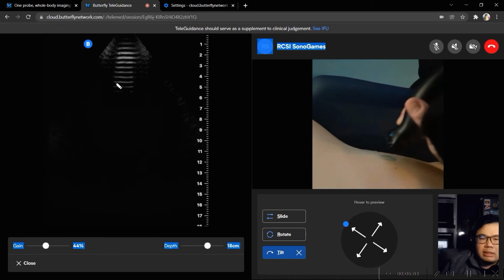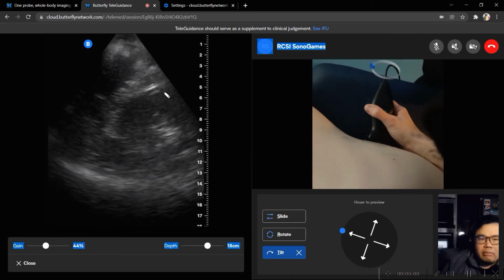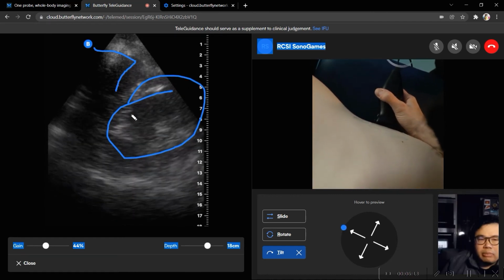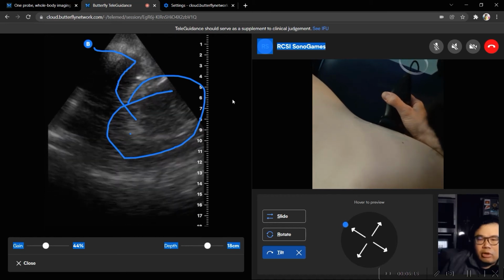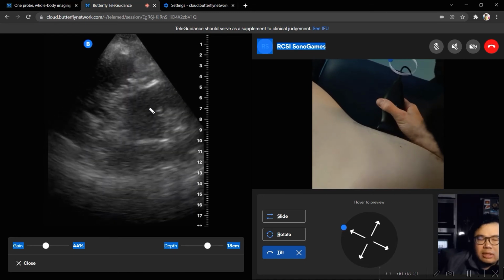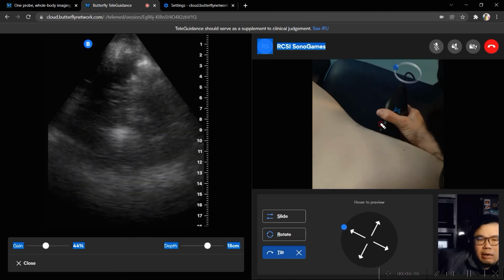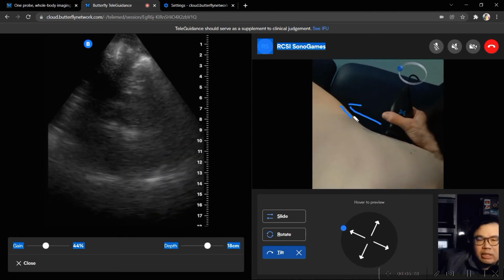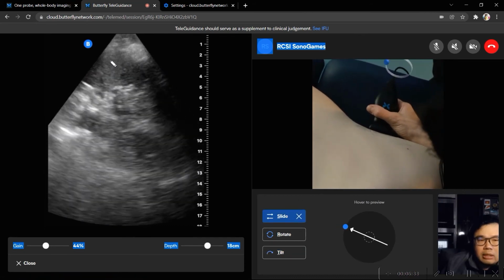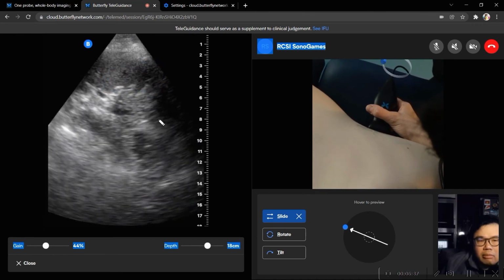So you can see a bit of spleen there when you did that. And then that's the kidney there. Okay, I'll take your word for it. If you're not convinced, then you need to make sure that there's good contact between the skin and the probe. Now, if you slide the probe just very slightly in that direction, you see how the spleen is appearing here? Yes. Now, what's the white stuff behind the spleen?